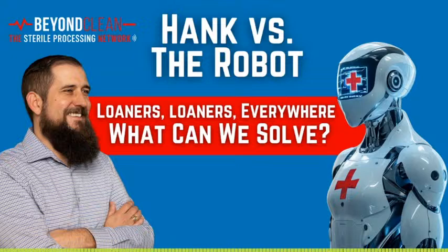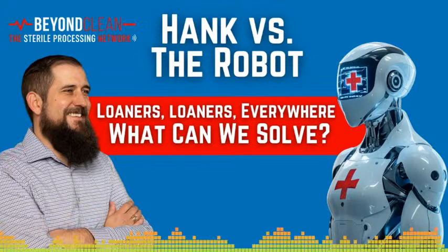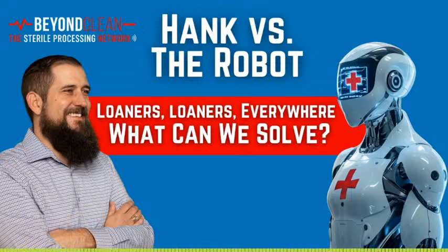They're also a lifeline for facilities during high case volumes. If you've got back-to-back surgeries, loaners can help fill in those gaps when your own sets are out of rotation for cleaning and sterilization. So they're not just about access, they're about maintaining efficiency and ensuring patient care doesn't miss a beat. But of course, with great utility comes great complexity, which is why we're here to dig into it today.